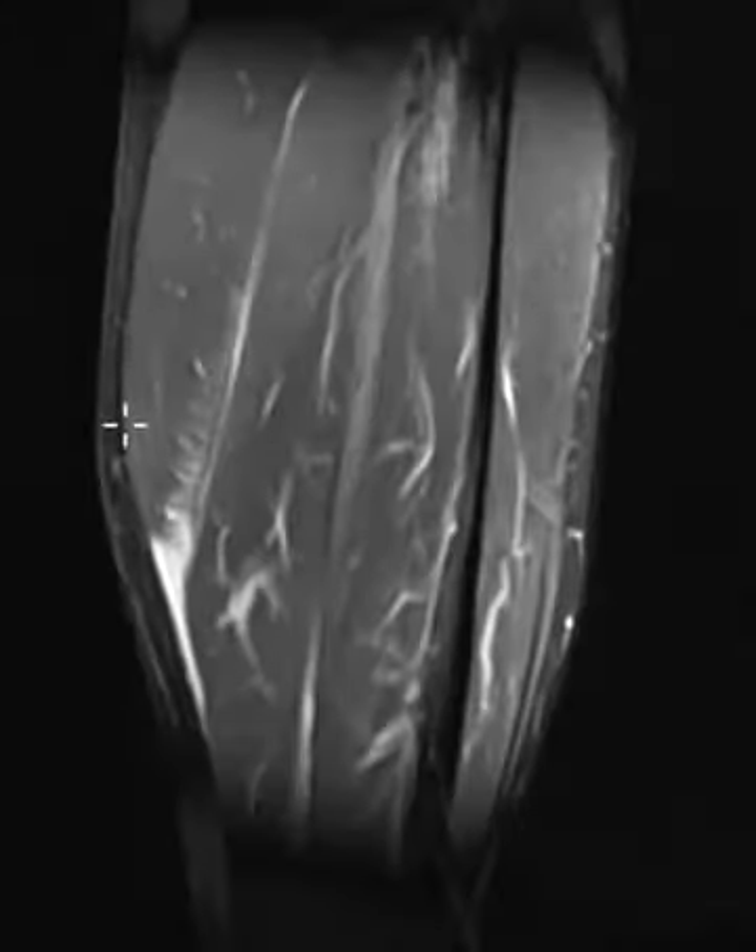Over on this medial side is where we have the problem. So this is the medial gastrocnemius coming down, looking good, but we get to here. The distal muscle fibers are frayed and feather-like, and they're torn right from here. Should attach right down here, but it's peeled up to over here, and there's hemorrhage and edema that undermines that. It's peeled right off and elevated.